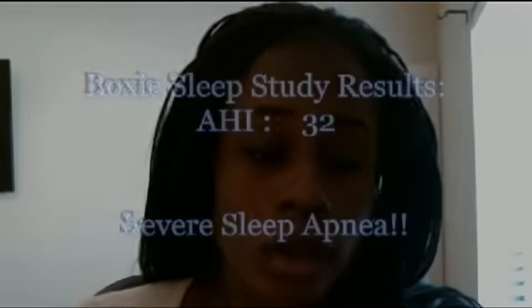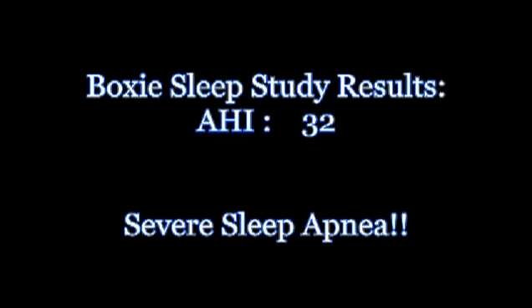So Boxy is a guy who has been put on the couch or in the spare bedroom because his snoring is shaking the walls. So his wife has said, Boxy, if you don't go do something about that snoring, you will not get back in this room. So Boxy's been in for his sleep study, found out he wasn't just snoring, but Boxy has severe sleep apnea. So here's Boxy's results. His AHI, his apnea-hypopnea index, or how many times per hour he stops breathing, is 32.